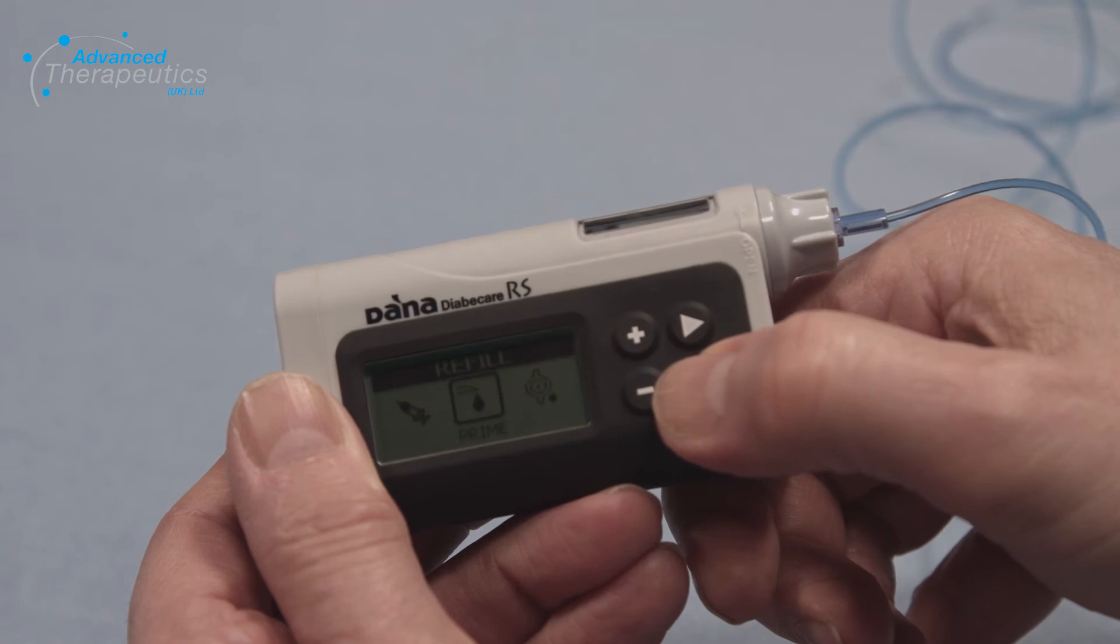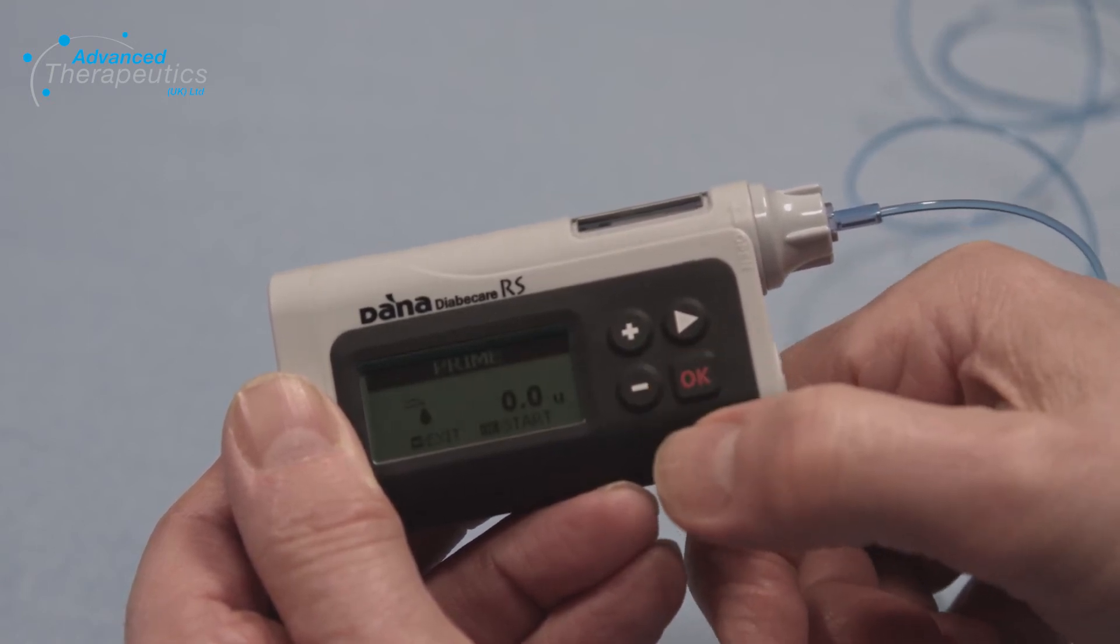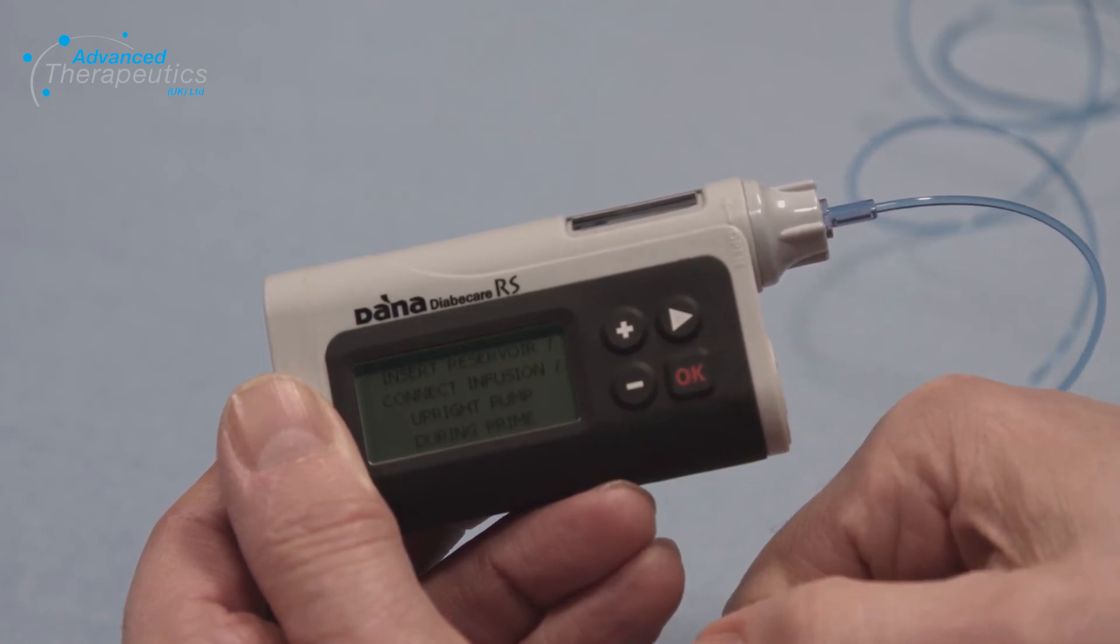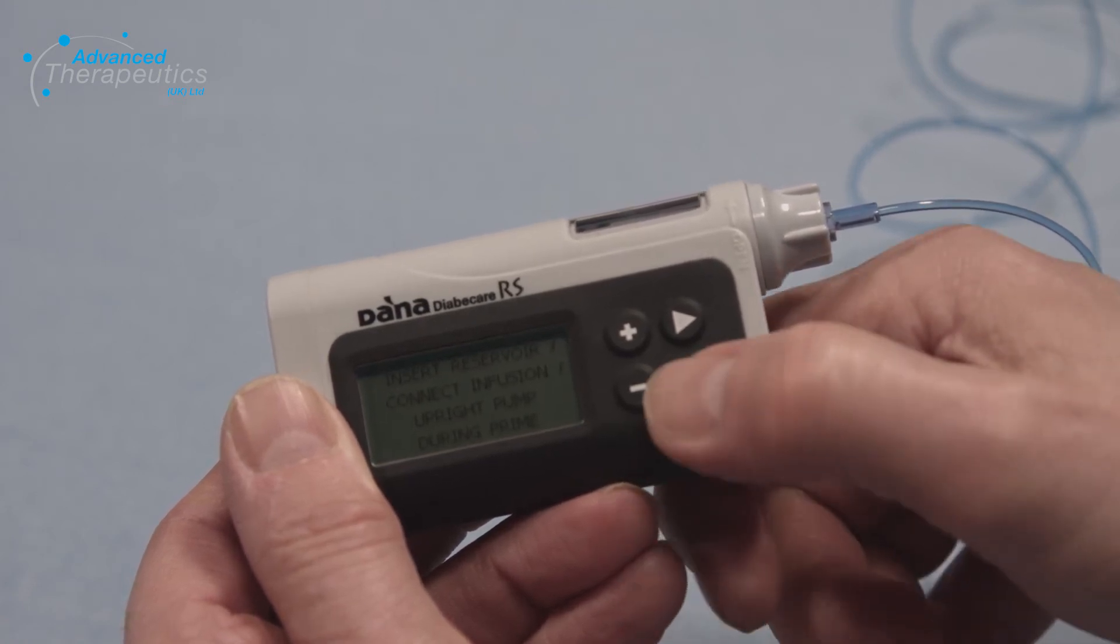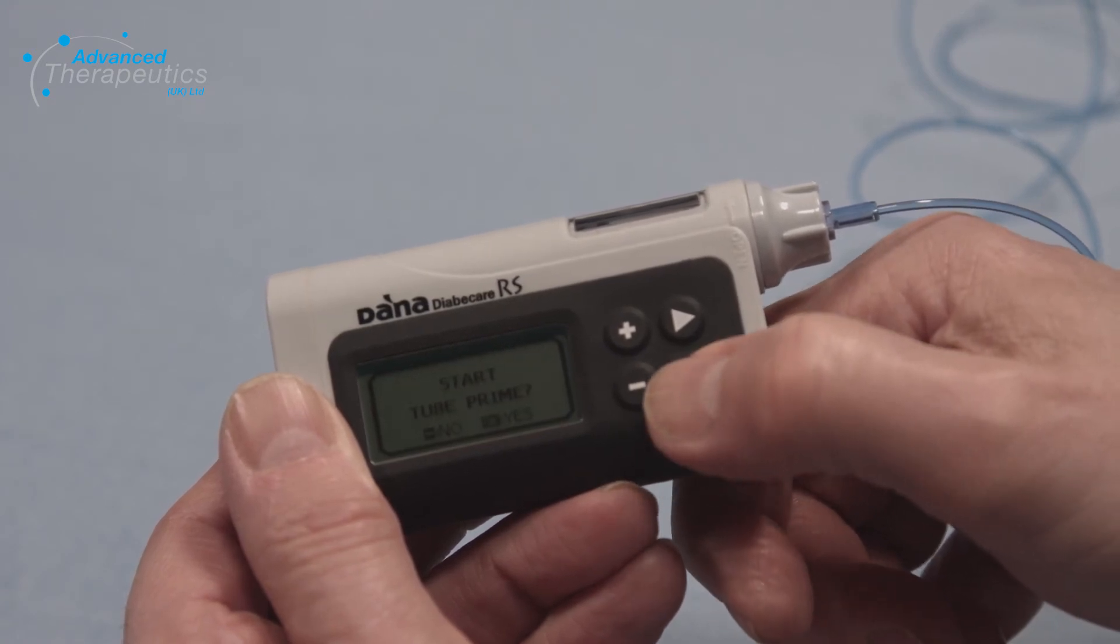The pump will now show prime. Press OK and then OK again. Instructions will ensure the reservoir is inserted and will guide you to hold the pump upright during priming. Press OK and then OK again to start the tube prime.